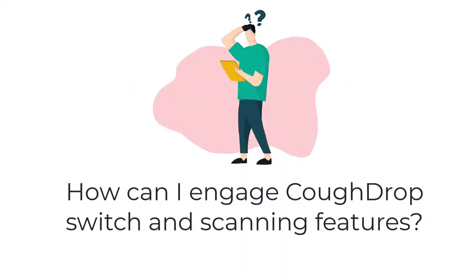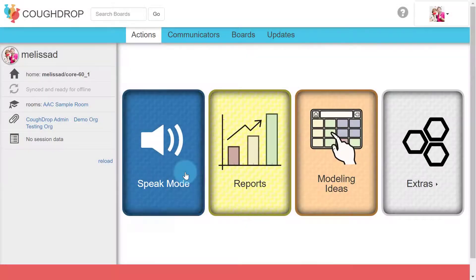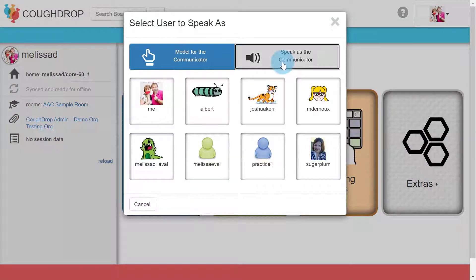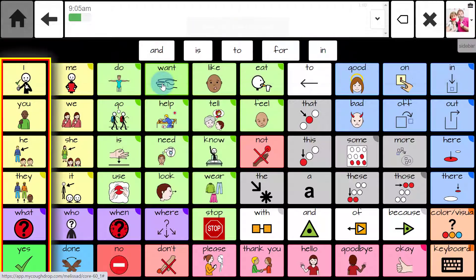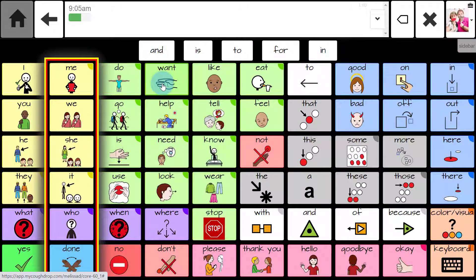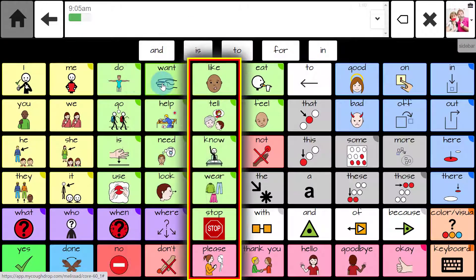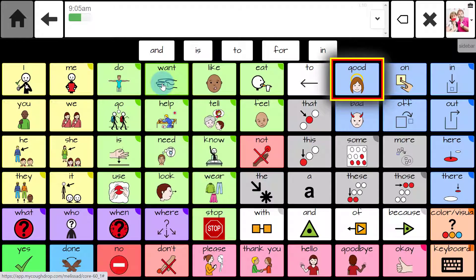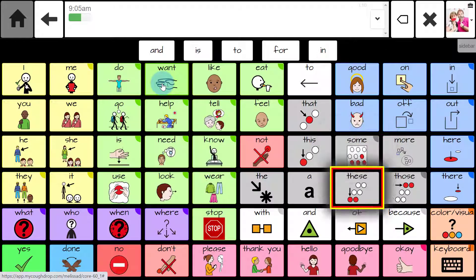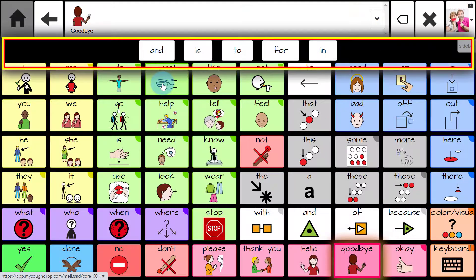How can I engage CoughDrop's switch and scanning features? Some users don't have the mobility needed to tap particular words on a screen or manipulate specific keys on a keyboard. For this reason, CoughDrop is able to function in scanning mode to accommodate keyboard taps for selections or switch-related use.